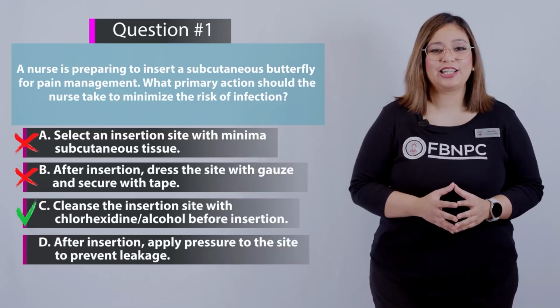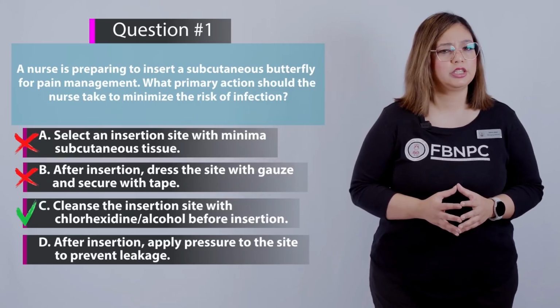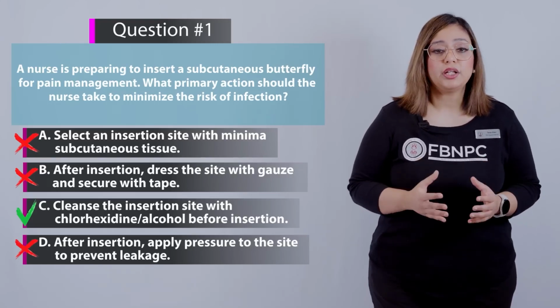All right, now let's look at the last option. After insertion, apply pressure to the site to prevent leakage. What did you learn in the video? That is incorrect because this is not an accepted practice and not necessary.